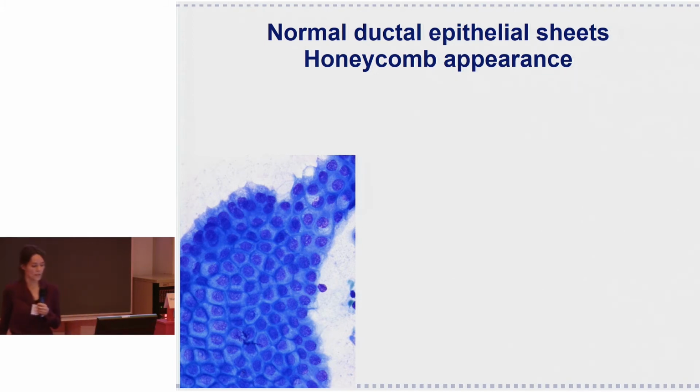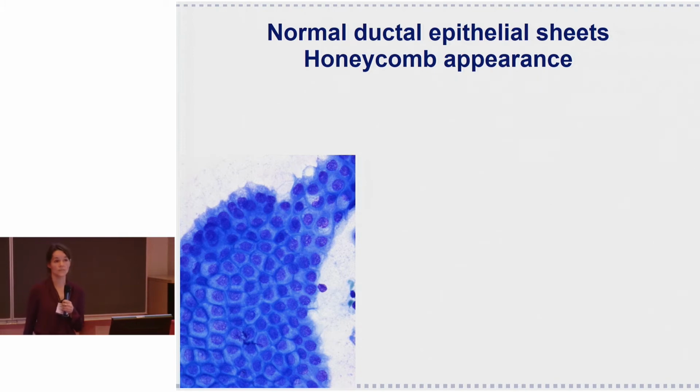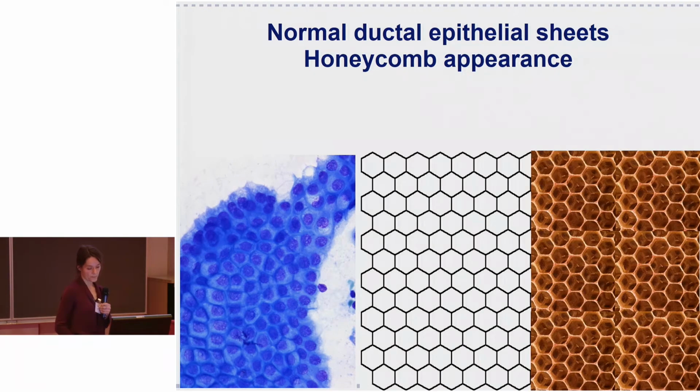But the first thing when you have the Giemsa stained smear is that you have another kind of material, another kind of staining. For us histopathologists, it's new stuff, right? It's another, less colored world, because we have blue and dark blue. We have the nuclei, we have the cytoplasm. It's a different kind of staining we have to interpret. But this is the normal ductal epithelium, and we train ourselves to recognize that because it's very regular and resembles a honeycomb. So you can appreciate the cells and nuclei next to each other and the margins of the cells. So that could be learned.